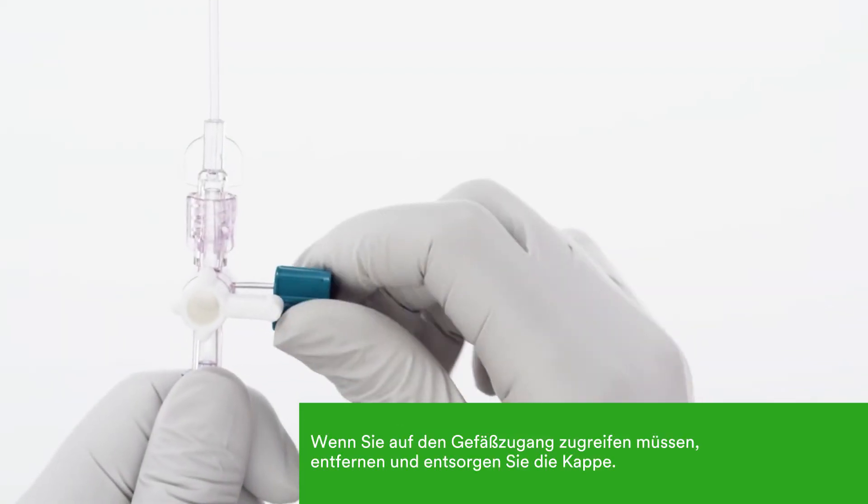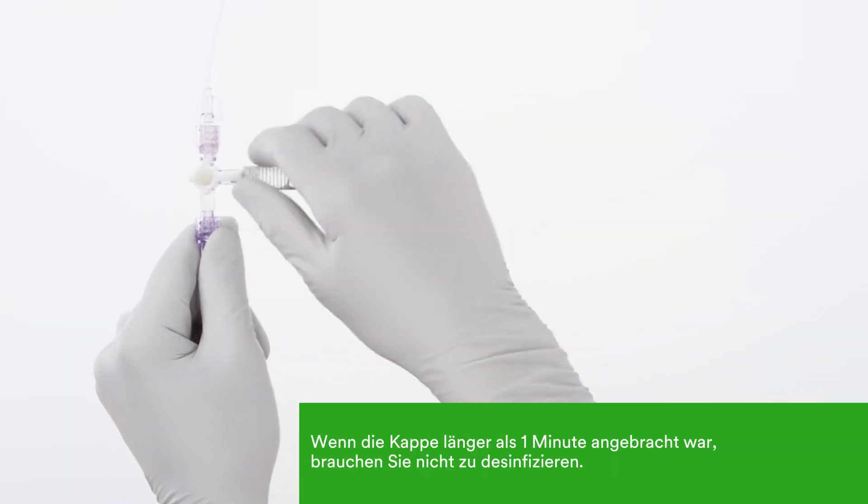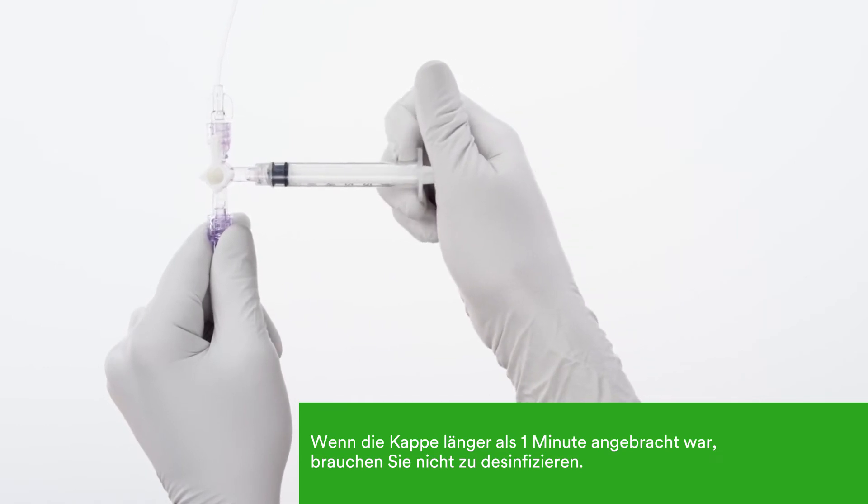When you need to access the line, simply remove the cap and discard it. As long as the cap has been in place for one minute or longer, there is no need to scrub.